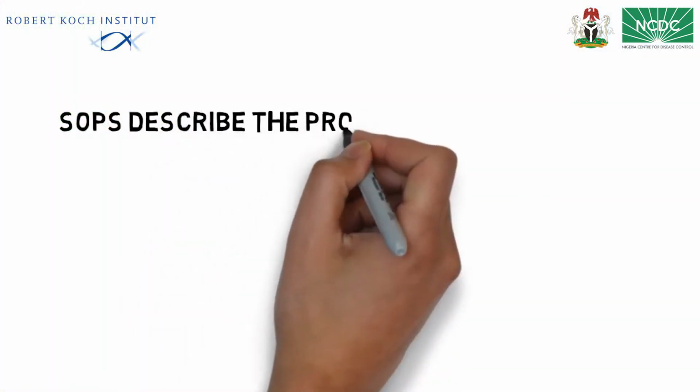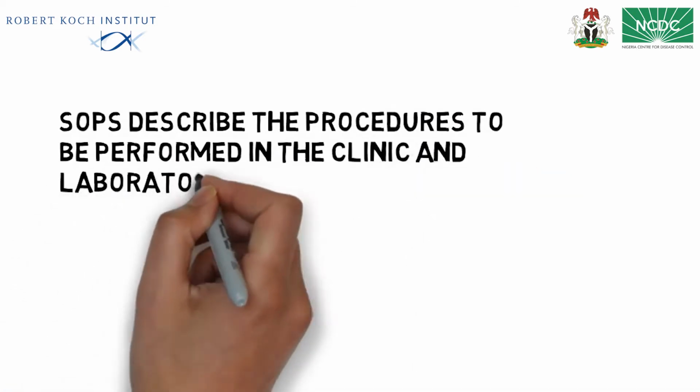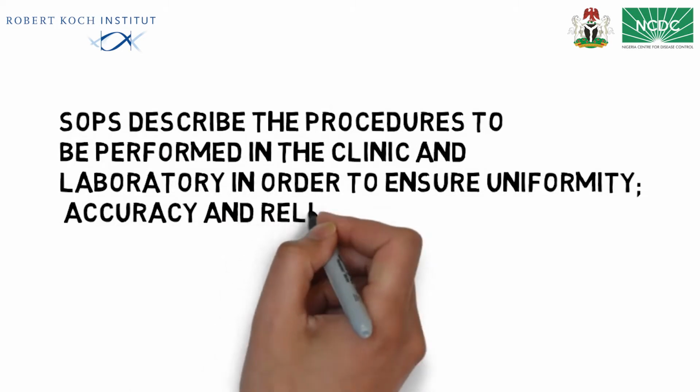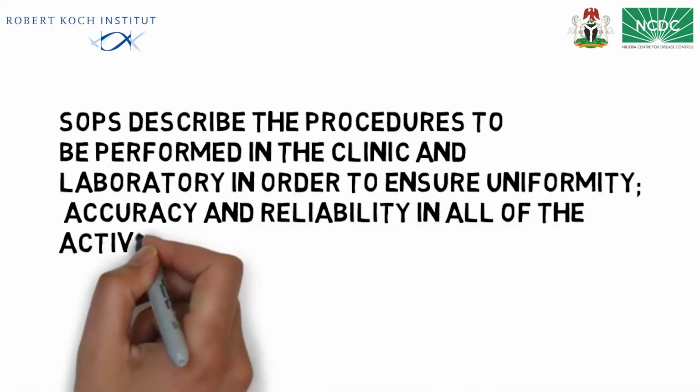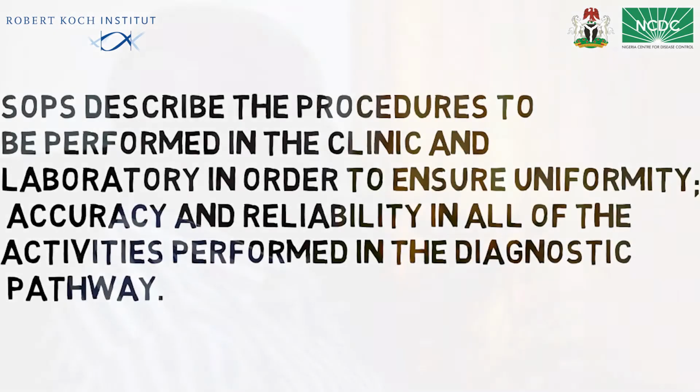Standard operating procedures describe the procedures to be performed in the clinic and laboratory in order to ensure uniformity, accuracy, and reliability in all of the activities performed in the diagnostic pathway.